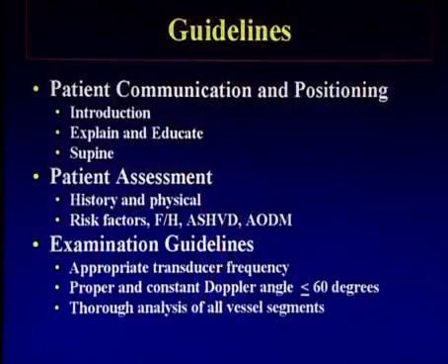Next, we go into the guidelines themselves, and that is divided into 7 sections. The first section is patient communication and positioning. In this section, you'll note that we talk about introducing yourself to the patient, explaining and educating the patient about the examination itself, and actually positioning the patient on the table for the exam, most likely in a supine position.